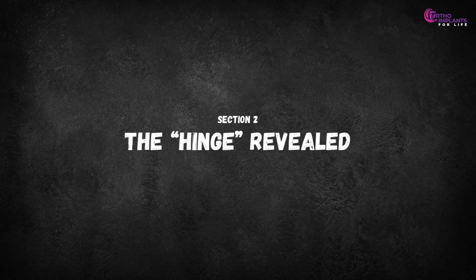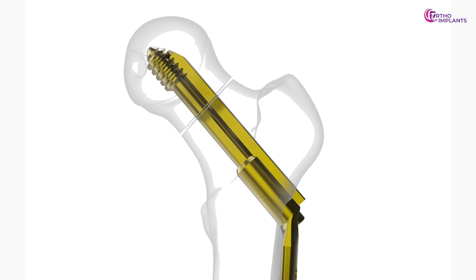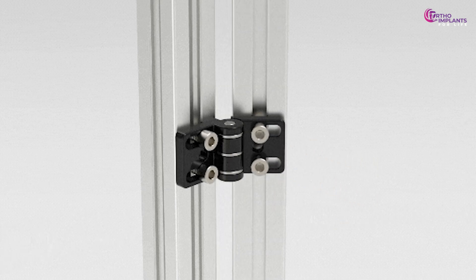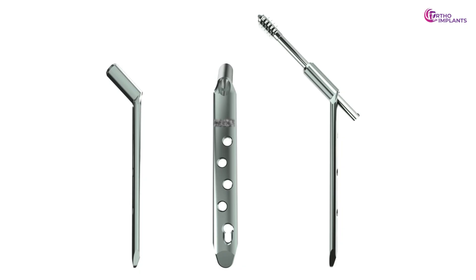Next, the hinge revealed. The secret lies in the DHS design. The lag screw sits inside a barrel on the side plate, allowing it to slide along the femoral neck's axis. Think of it like a door hinge — it slides under load, permitting controlled movement and fracture compression, which accelerates healing. This isn't instability; it's precision-engineered motion.